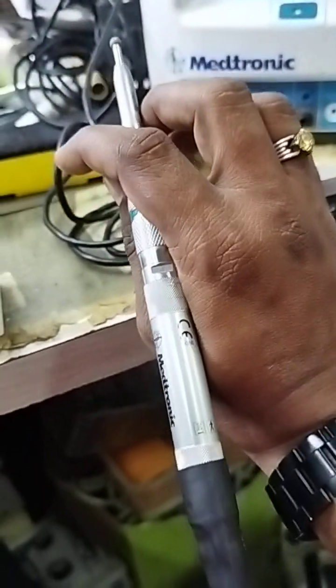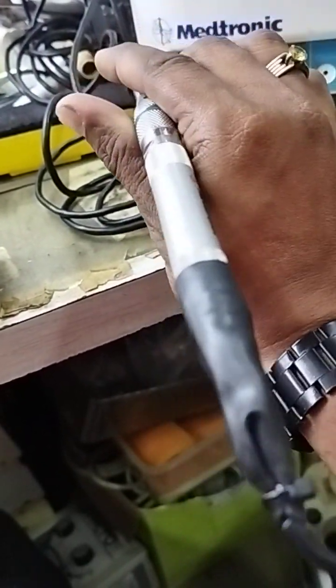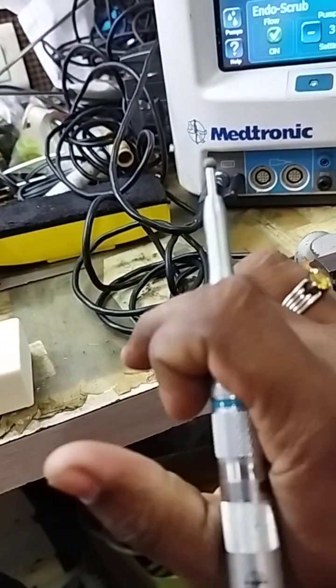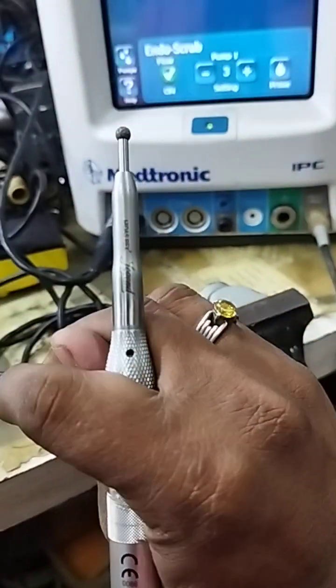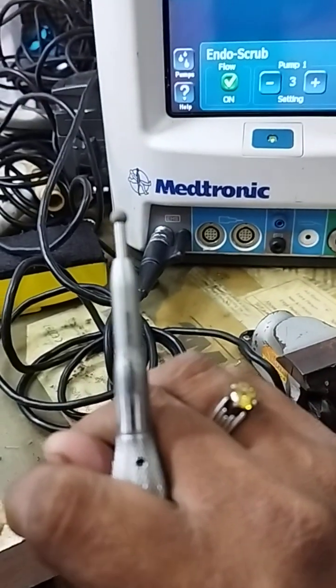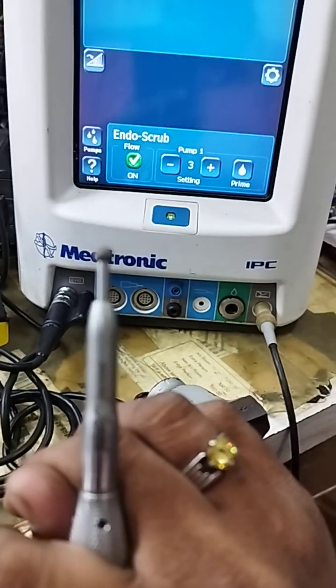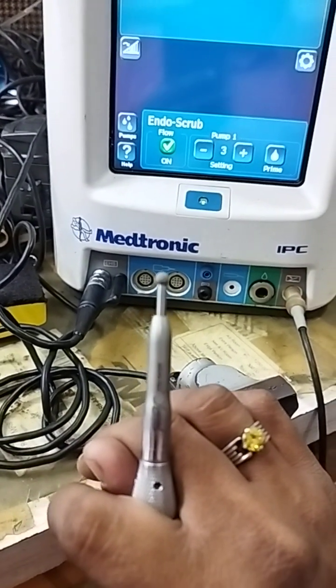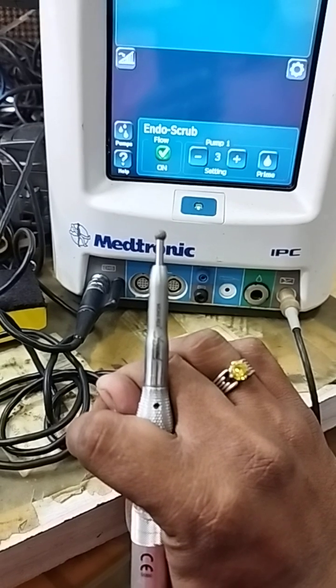This is the motor we received for service — you can see its condition. The customer had already tried somewhere else and it was not working. The complaint is that whenever load is applied, the burr is not rotating automatically. While we received it, I found the issue while drilling out.